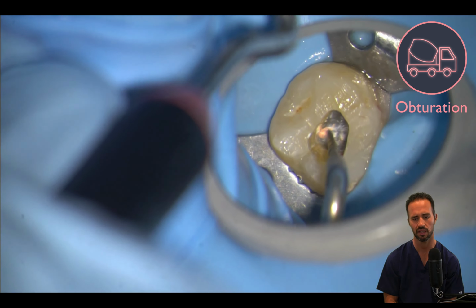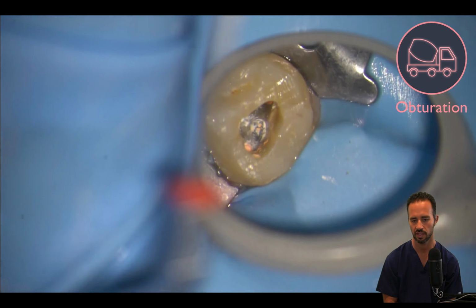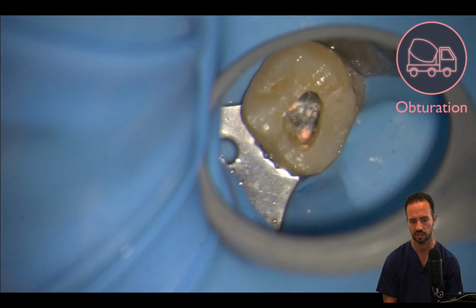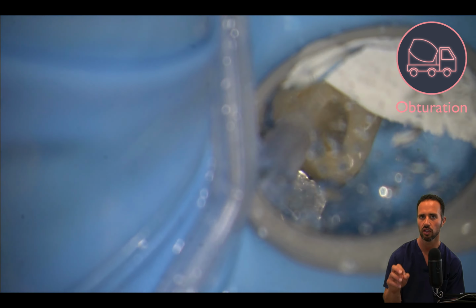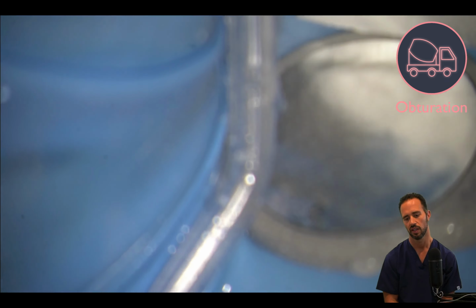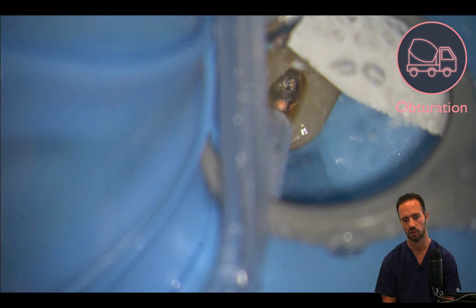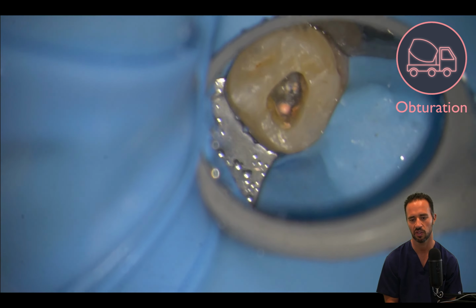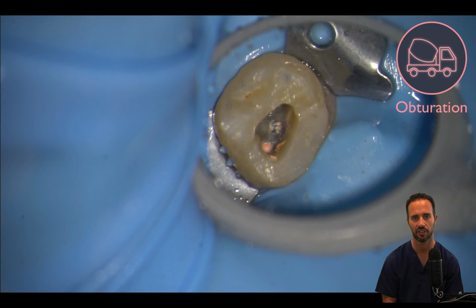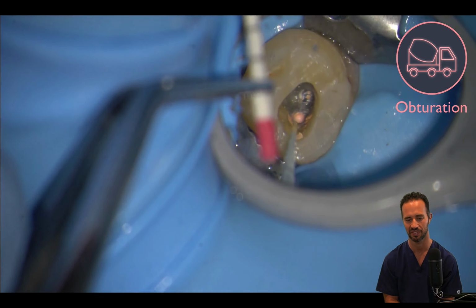Looking good, and take your time with this cleanup job. You don't want to rush this. You want to make sure that there's no excess sealer and gutta percha. And in the area where you prepared looking for the MB2, you're going to have a little gutta percha that wants to stick in that region. Don't kid yourself and make it look like you went ahead and found and filled an MB2. Just take away any excess gutta percha. There's really no need for that.